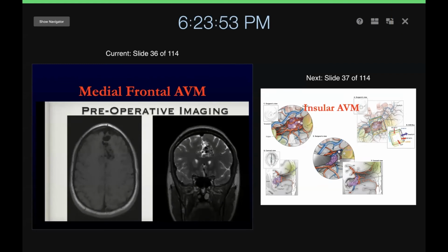Here is where we're really getting into that lateral space. You see here, the AVM just wants to fall away from the brain into almost into the surgical corridor or into my lap. And it's helping me see the deeper I go. And that would not have been the case if we had put the AVM on the opposite side. So here's just more work getting around these things. Here's this big venous varix on the back.